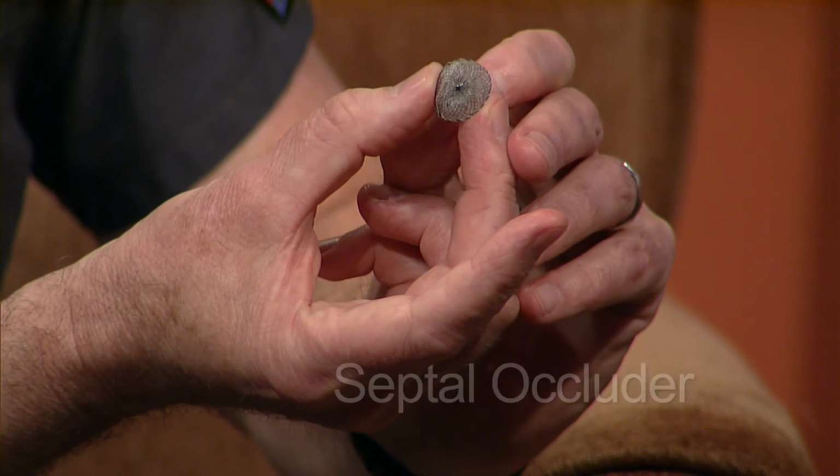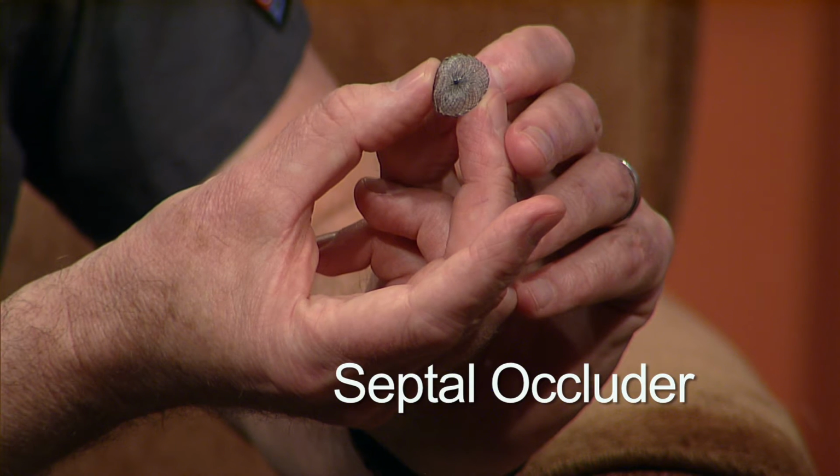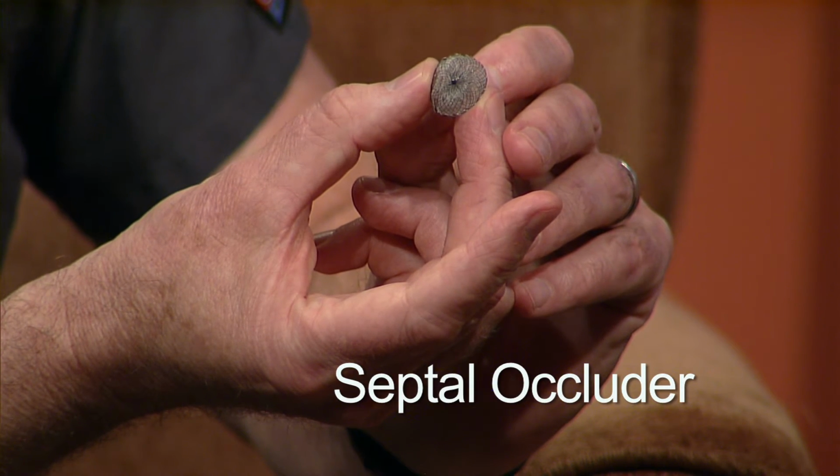With CAS. This is for a hole in the heart. So this is called a septal occluder. Now tell me, a hole in the heart, what part of the heart, and how could there be a hole in the heart? Well, this is typically, a person is born with this. So it's between the right side of the heart and the left side of the heart. So for example, an atrial septal defect between the two atria, or ventricular septal defect between the two ventricles. So there's a hole between the two hearts, and the pressure makes the blood go where it shouldn't be going.